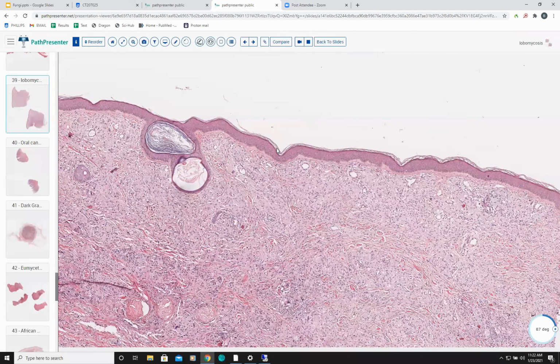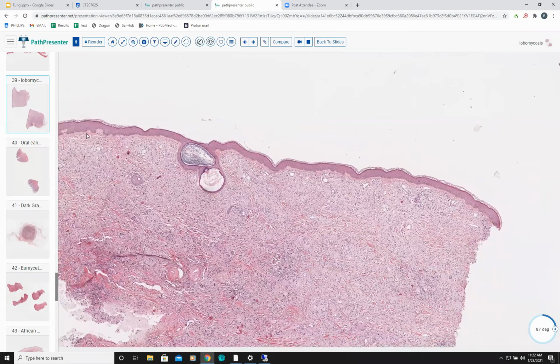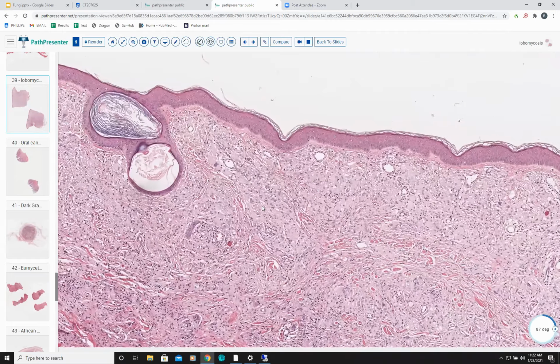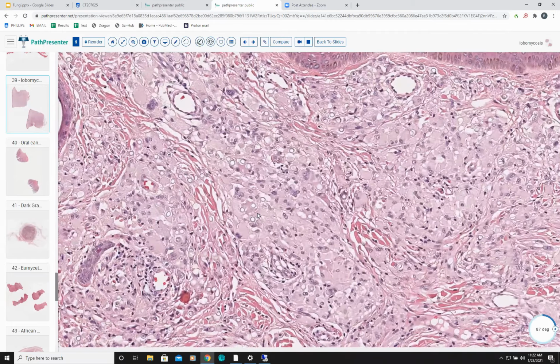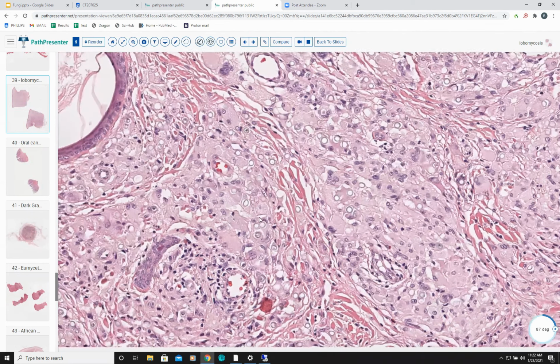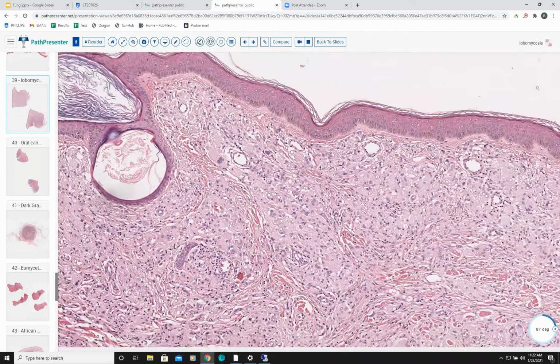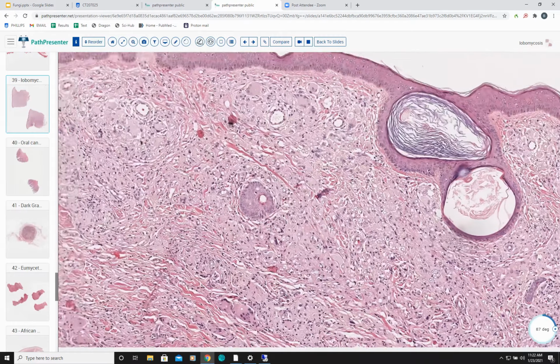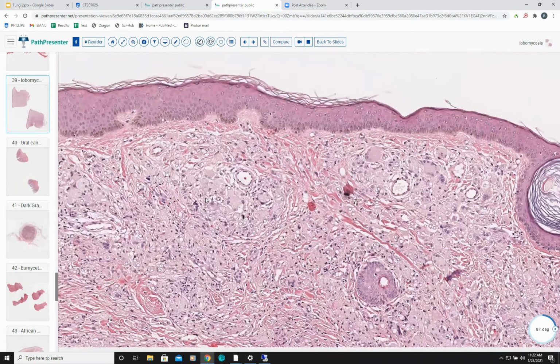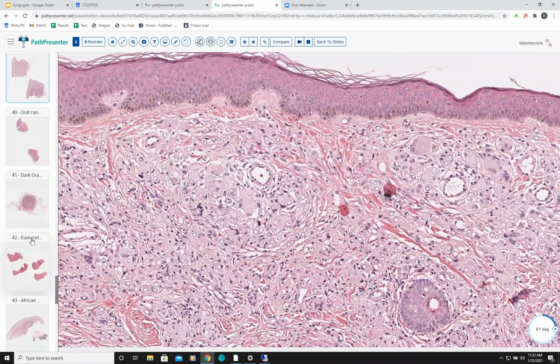And here's another more characteristic lobomycosis where you see epidermal mild atrophy, loss of the rete ridge pattern, a dense granulomatous infiltrate, foamy histiocytes, and many, many of these organisms or spaces where the organisms were. These look to me like they're picking up some stain. So this is lobomycosis. They like this on boards as well because many organisms without the pseudoepitheliomatous hyperplasia.